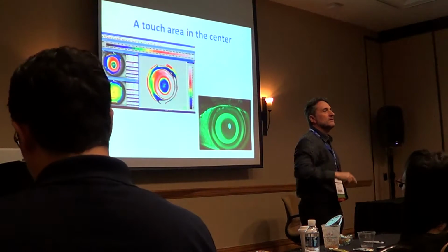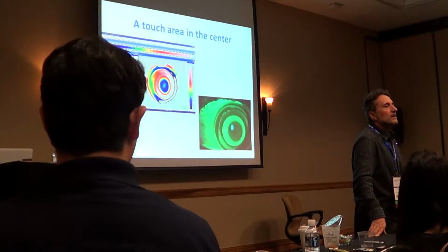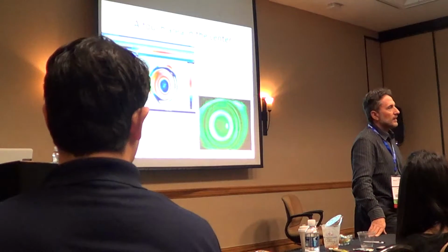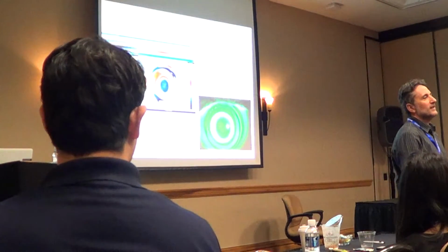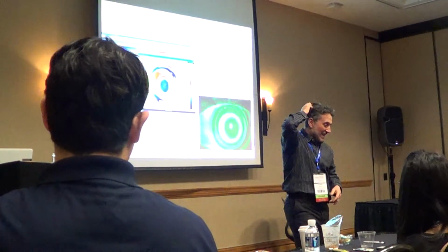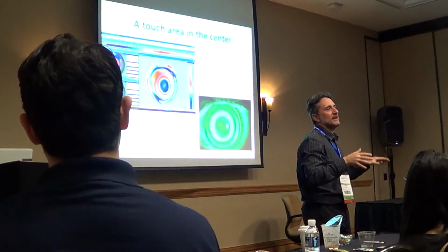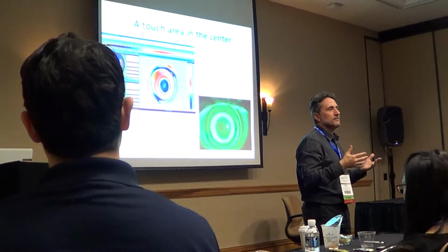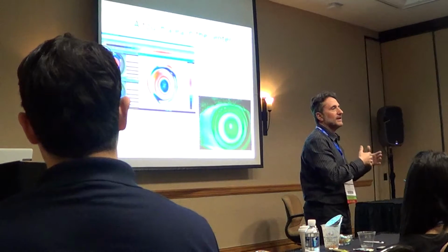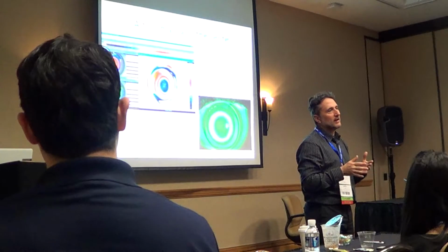Okay, the question: from your experience, over 50% of central islands can be fixed by increasing the sagittal? Yeah, in my humble opinion, 100% of central islands. No, 99%. Okay, this is a tough point because books say the opposite of what I say. The only thing I can tell you is that's my experience. I solve it this way, and I will show you a picture about that. But try for yourself. It's very easy.